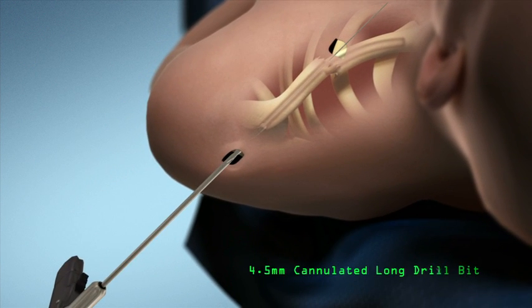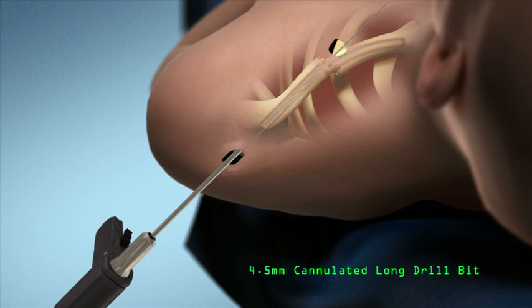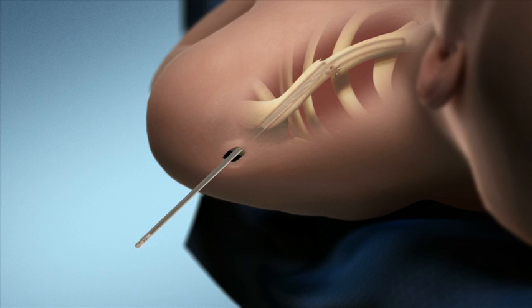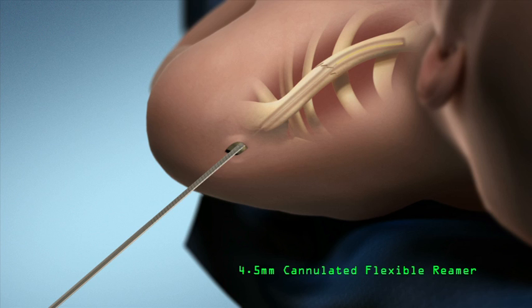Drill over the K-wire with the 4.5 millimeter cannulated drill from lateral to medial to the fracture site. Remove the K-wire from the drill. Reduce the fracture. Insert the spade tip guide wire through the drill and into the medial fragment. Remove the drill bit and advance the 4.5 millimeter reamer over the guide wire. Ream to the tip of the guide wire.